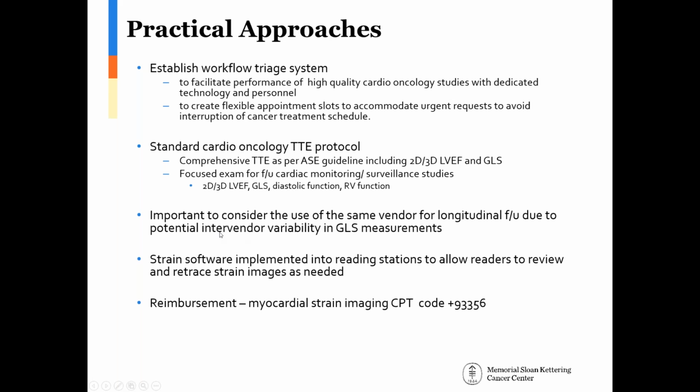And as already mentioned, it's important to consider the use of the same vendor for follow-up studies, given the potential inter-vendor variability in GLS measurements. One way of getting around that, of course, is to use a vendor-neutral system if trying to stay with the same system presents logistic issues.